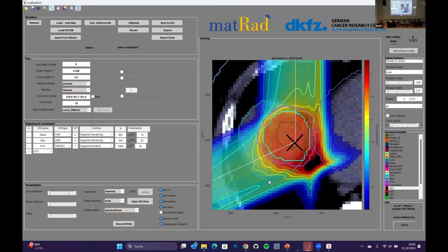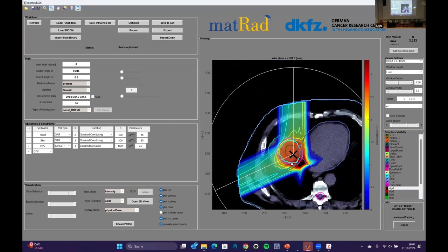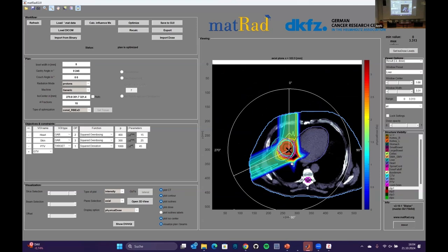And if you have an image exactly when you treat, it's not a good image. It's maybe a cone beam CT image, which has worse image quality even than a CT. So there are multiple problems where this uncertainty comes from, and combined with the physics at play, namely the high dose peak at a specified depth, we get an uncertainty problem. It's kind of a combination.